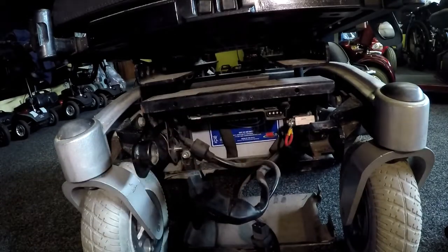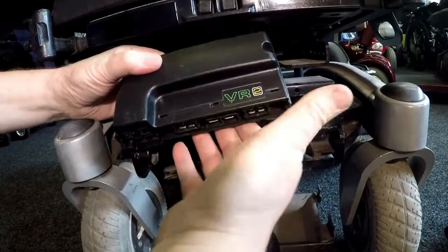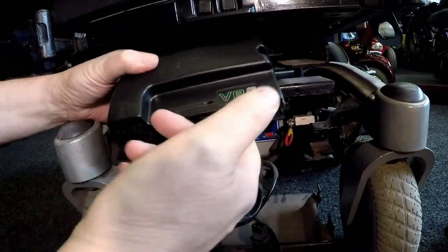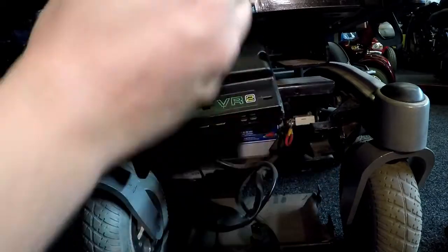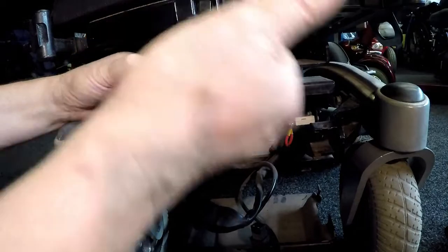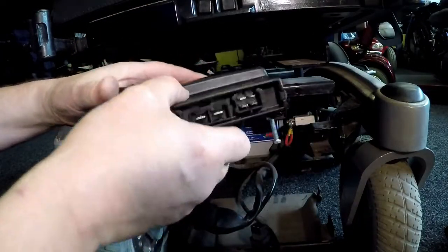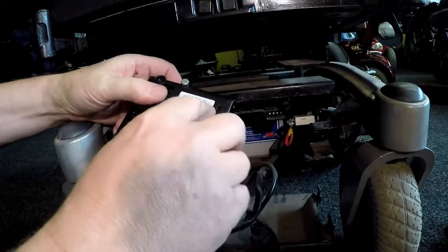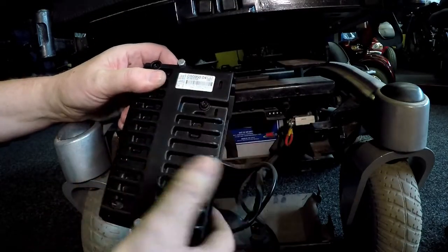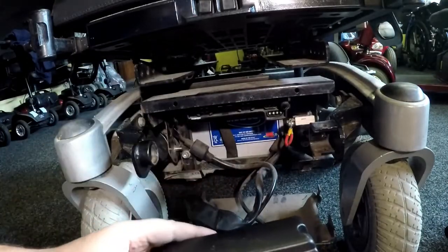Now, these power modules that you can buy, got one here, VR2. They're all different. If you see a VR2, it may be different software in it. So if you put a VR2 that's got the wrong software on this, you could damage the motors, damage the brakes, damage the drive, and maybe not work the same. They're all different rated. Some can be 70 amp, some more. This is a 50 amp one. So I'm not going to drive the chair with this, because the software may be incorrect.